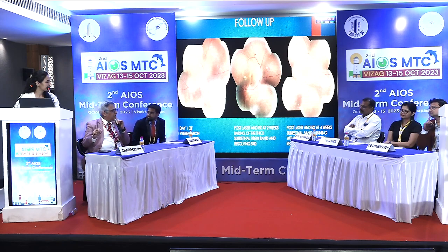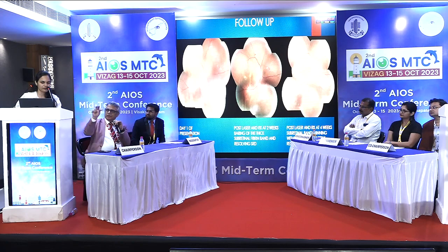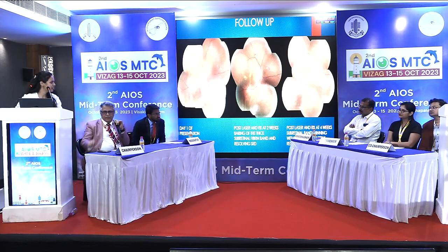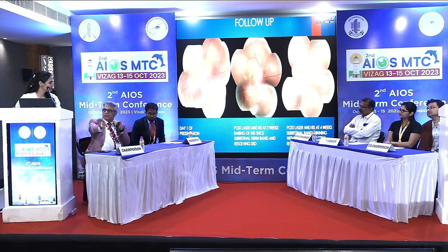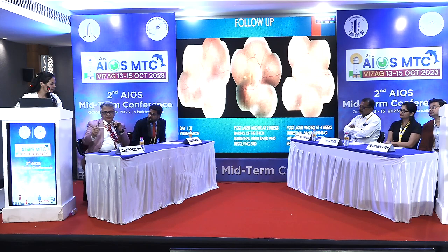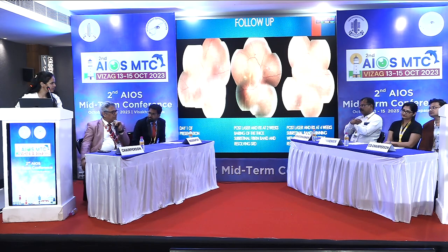So I would have actually, do you have any laser photographs? You should show one FA where you show the laser marks. I don't have that right now. You must have lasered that smokestack leak. Yes, definitely, we do. So that should also be part of the presentation. Because you have just orally told that laser was done, but angiography will show those laser spots.